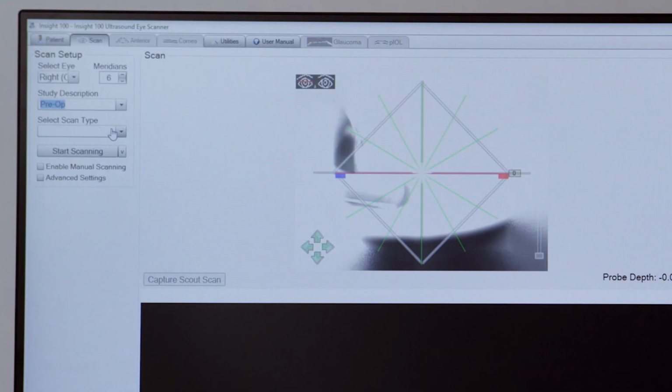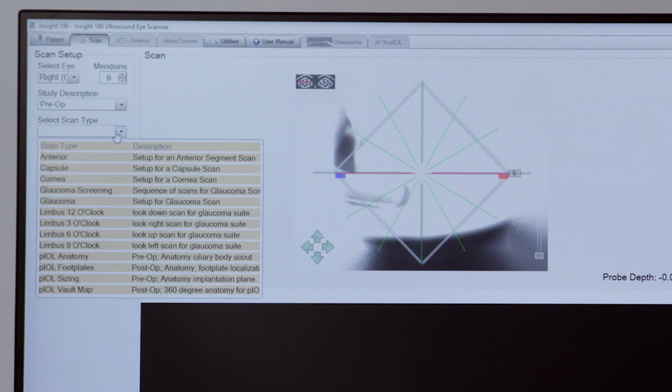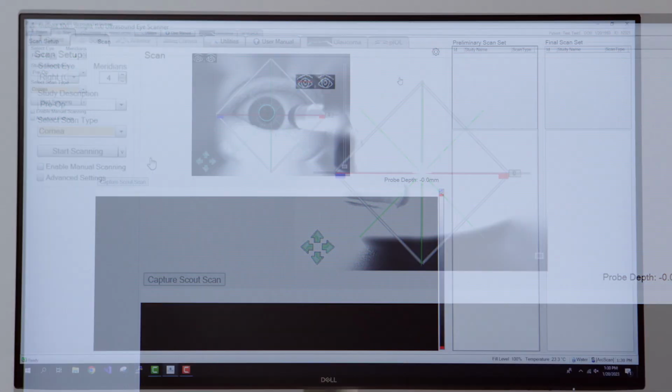There are two types of scanning methods. Automatic, where the software has certain defaults, and manual, where you control the centering and the placement of ideal focal depth. We'll look at both in this video. Make sure you've selected the scan that you want. For this video, we'll do an automatic cornea scan first.